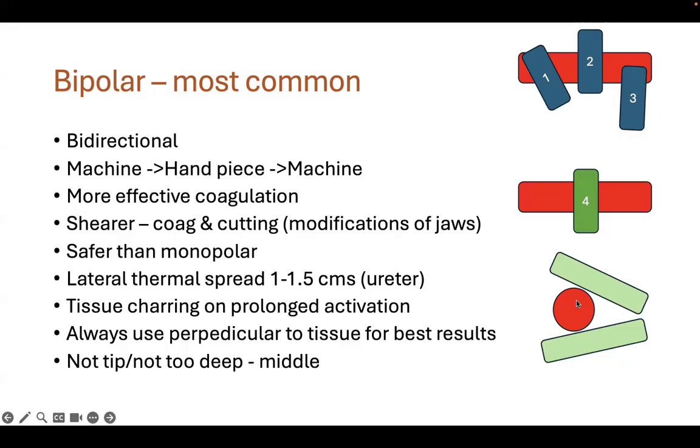You can either use an irrigation cannula and pour some water on it to hydrate the tissue. And when you start firing again, you'll see fresh bubbles appearing on the tissue again, getting cooked. So this will confirm that your vessels have been totally cooked or sealed before you're cutting.